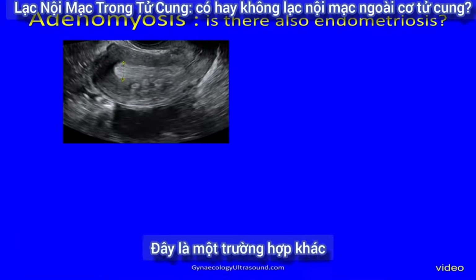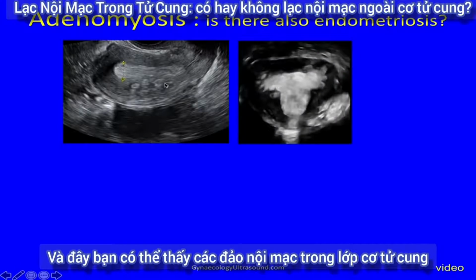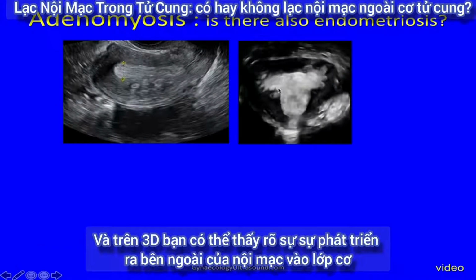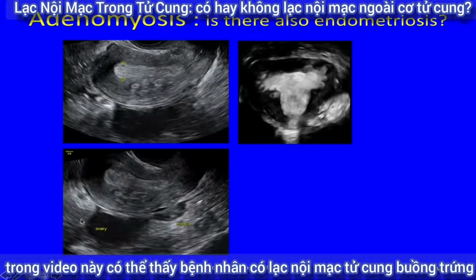So this is a different case. This is the endometrial cavity. And here you can see islands of endometrium in the myometrium. And on 3D, you can clearly see this outbudding of endometrium into the myometrium. So does this patient also have endometriosis? And in the video clip, you can see she has an ovarian endometrioma.